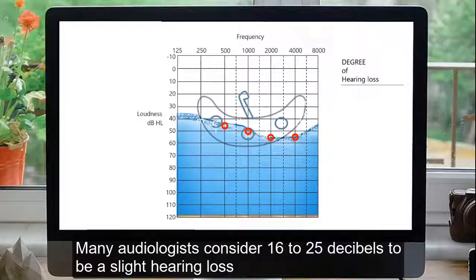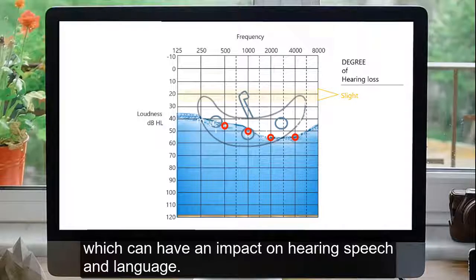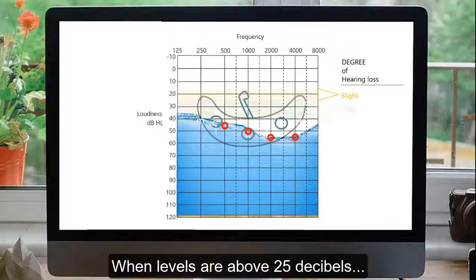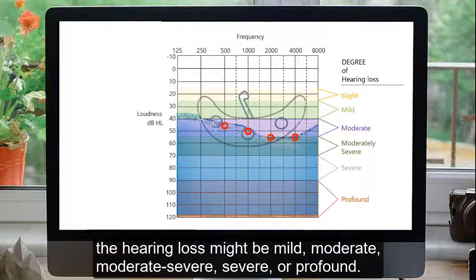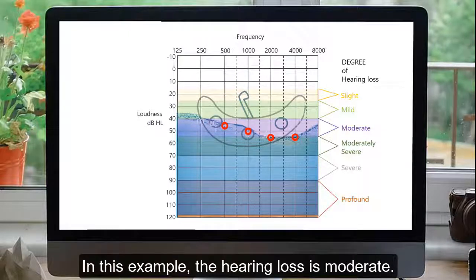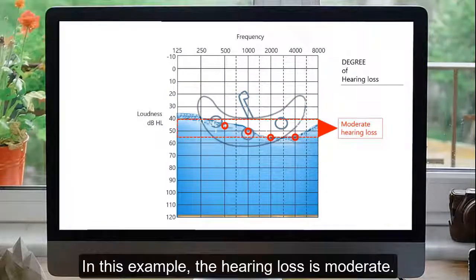Where the waterline falls across the first three thresholds shown here will help to define the degree of hearing loss. Many audiologists consider 16 to 25 decibels to be a slight hearing loss, which can have impact on hearing, speech, and language. When levels are above 25 decibels, the hearing loss might be mild, moderate, moderate-severe, severe, or profound. In this example, the hearing loss is moderate.